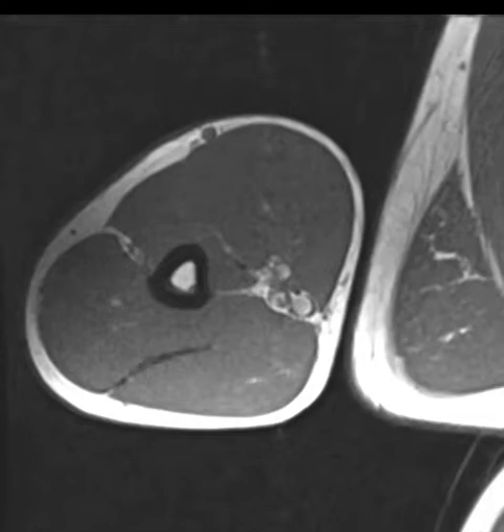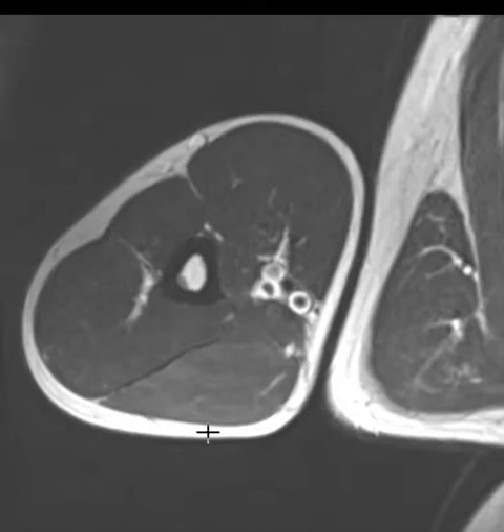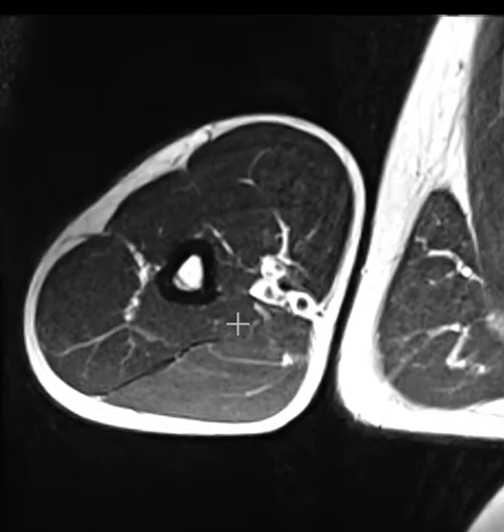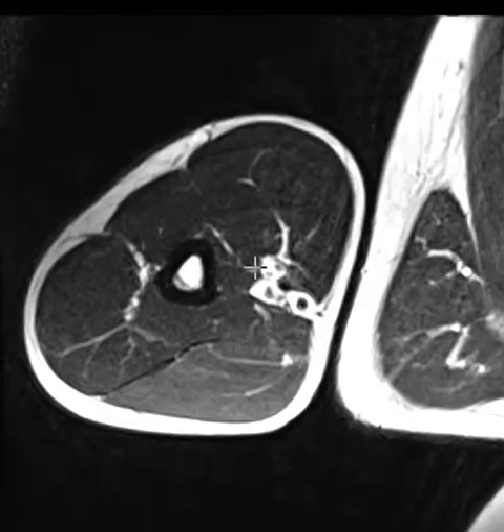If we put up a T2-weighted view, things look really similar — bright subcutaneous fat, bright fatty marrow, dark cortex. These are the neurovascular structures. On T2, fluid would now show up as bright in the muscle. But I don't see any obvious fluid collection in the muscle. As we go through the slices, things are pretty good, except when we window this we can start to see the contrast a bit more clearly.